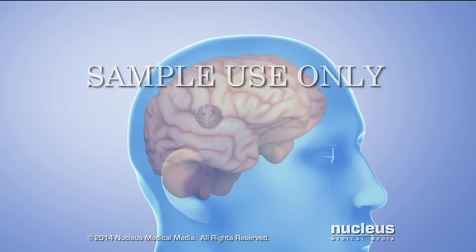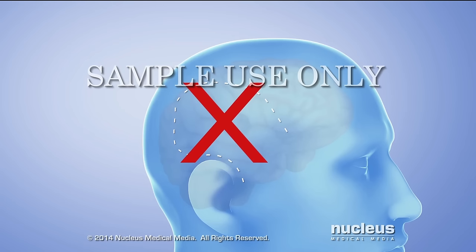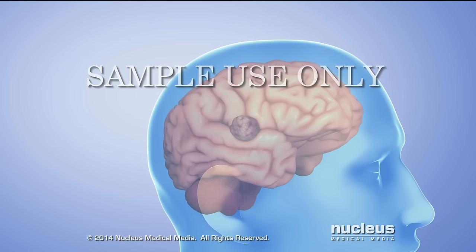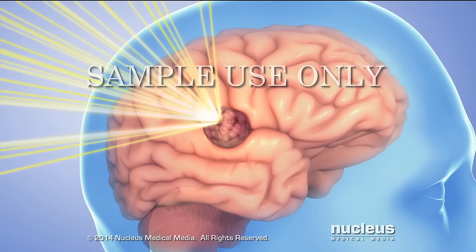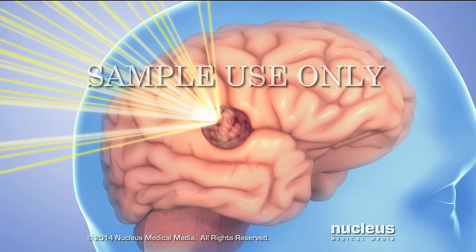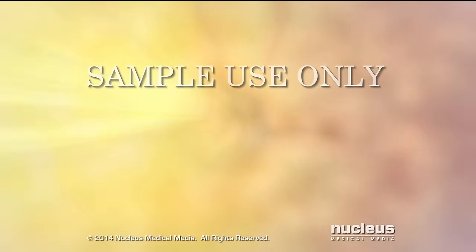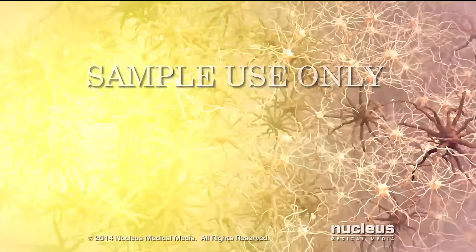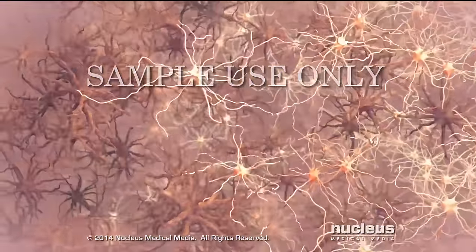The Gamma Knife is a non-invasive surgical procedure that doesn't require incisions, which are cuts through the skin. Instead, a machine precisely focuses and delivers about 200 beams of radiation onto a target area inside the head. The radiation only kills abnormal cells, while sparing the normal tissue around them.